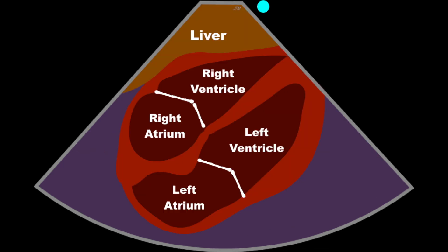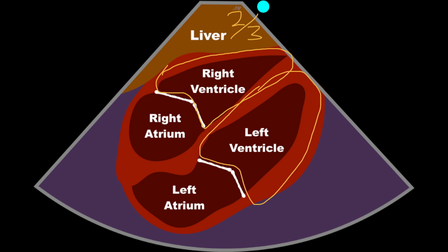We can also look at the sub-xiphoid view and compare the right ventricle to the left ventricle, though it's not as good as the apical view. But if we were to look in this view and see a right ventricle that is greater than two-thirds the size of the left ventricle, we'd want to be concerned that there's enlargement. This view can underestimate the size of the right ventricle at times, simply due to the fact that you may not be exactly in-plane and the right ventricle does not have as strong an appearance in the sub-xiphoid view compared to the apical view.